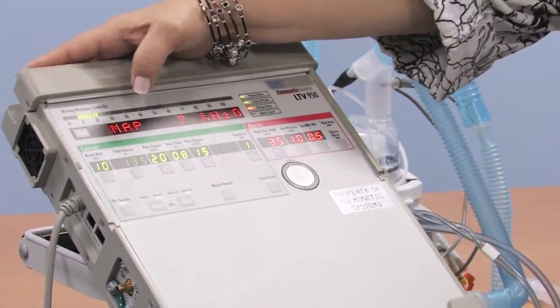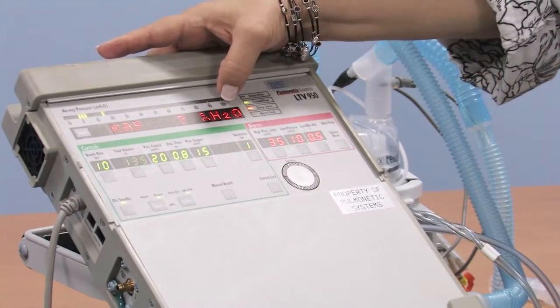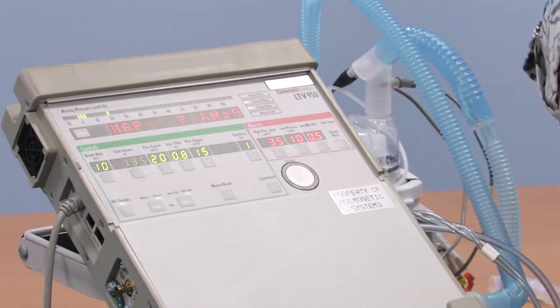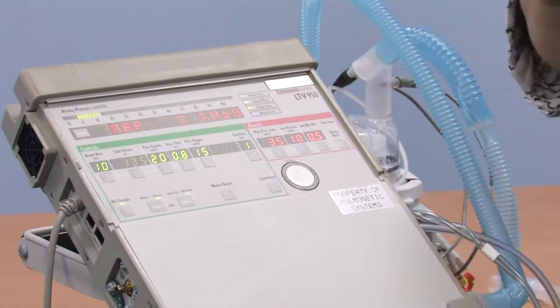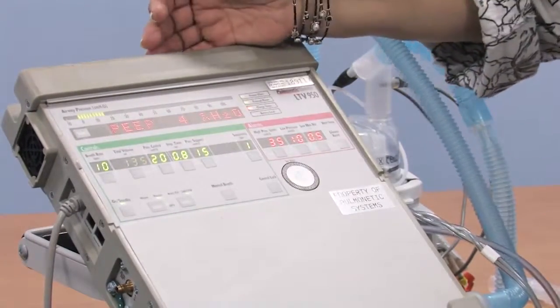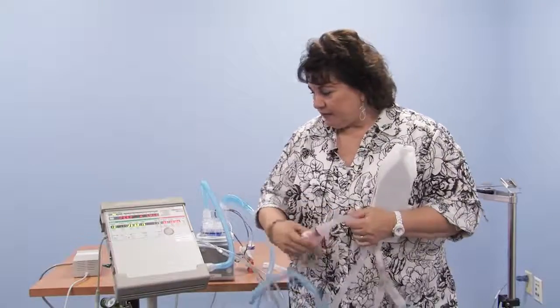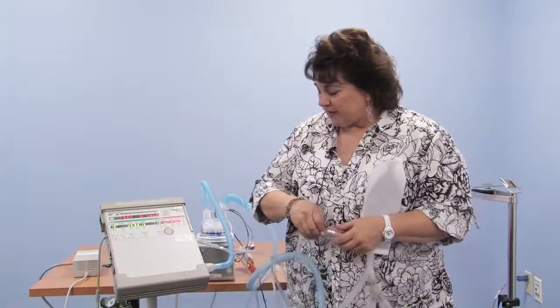After the peak inhale pressure, we look at MAP or mean airway pressure. There is nothing for you to set or adjust. This mean of 7 just tells me, the practitioner, how much cumulative pressure we're applying to your child's lungs to support them. The higher the mean, the higher the ventilator support. We can look at the PEEP here. So I said to you, well, it looked like it was 5, but the machine's saying it's 4. So we can adjust our valve a little bit to make it more often, say 5.